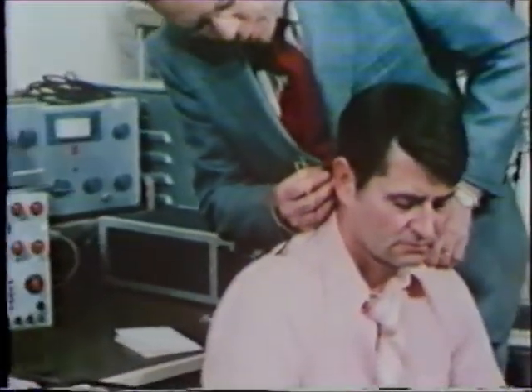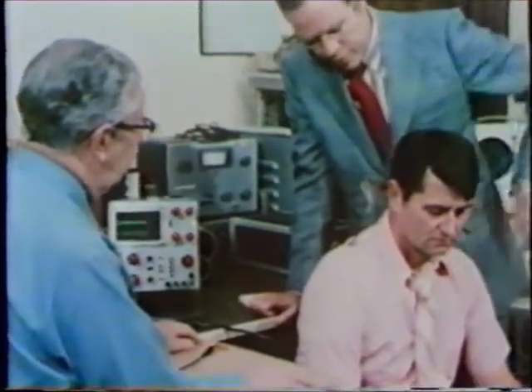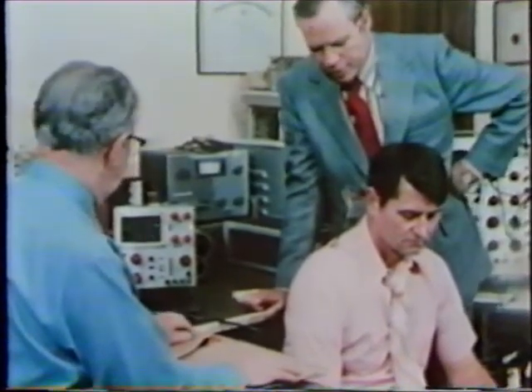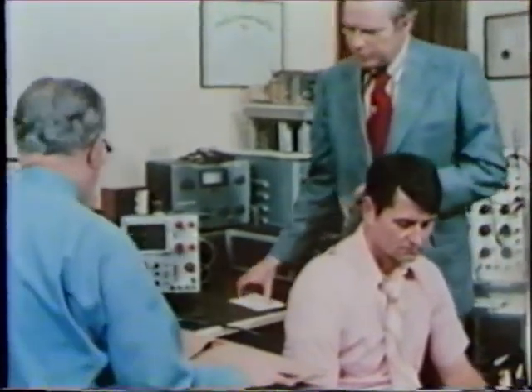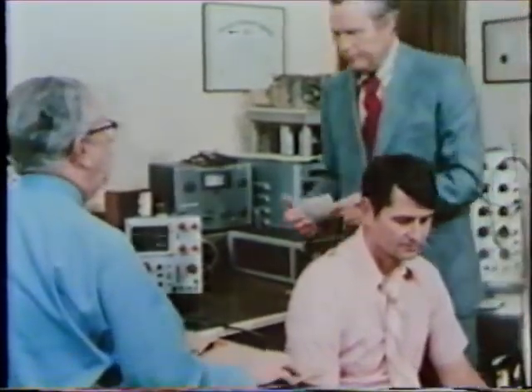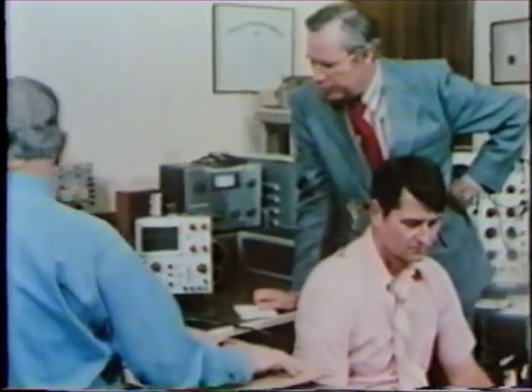Connected into the implant button, and we're going to now measure Mr. Grazer's threshold for electrical stimulation and also the type of current that he perceives, that gives him a perception of sound, and we'll ask him to describe those tones as he hears them. All right. Okay. Would you like to start out with a 30 cycle? Yeah, let's start with 30 and then we'll build up.